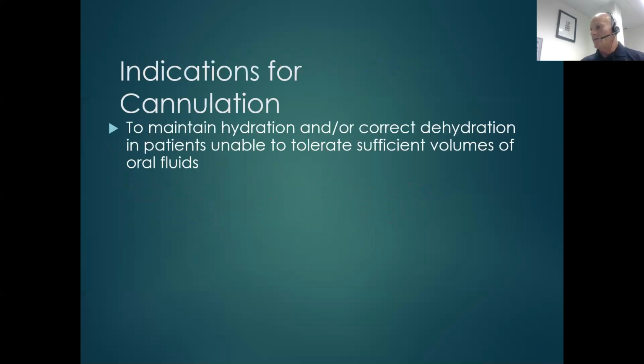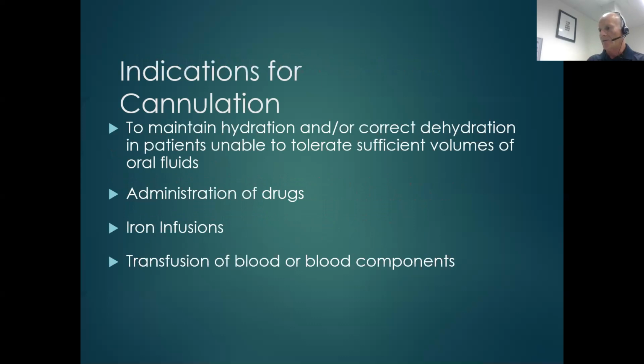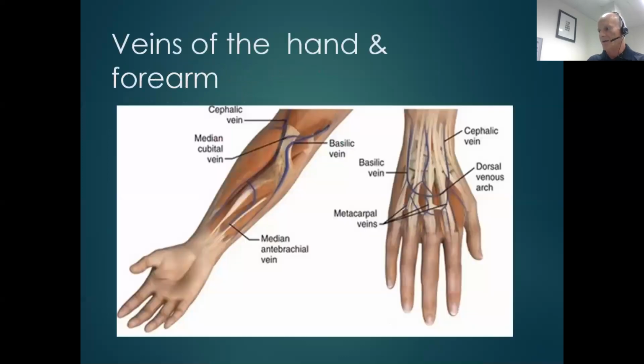Indications for cannulation. So what are the indications? To maintain hydration and/or correct dehydration in patients unable to tolerate sufficient volumes of oral fluid. Administration of drugs, iron infusion, transfusions of blood or blood components, contrast for radiological studies. And then we get on to the veins themselves.